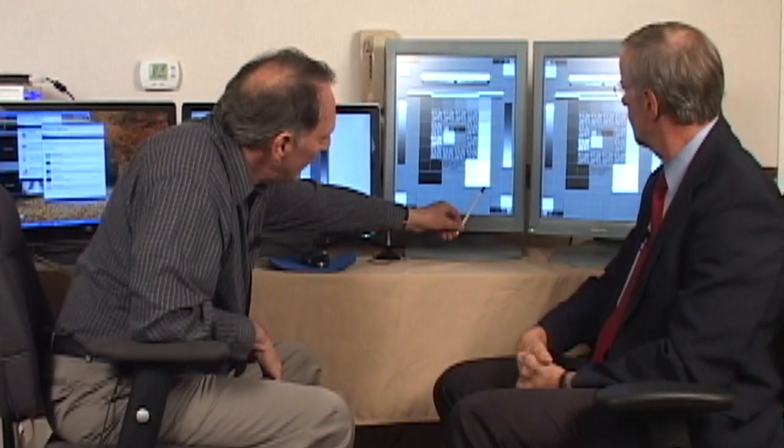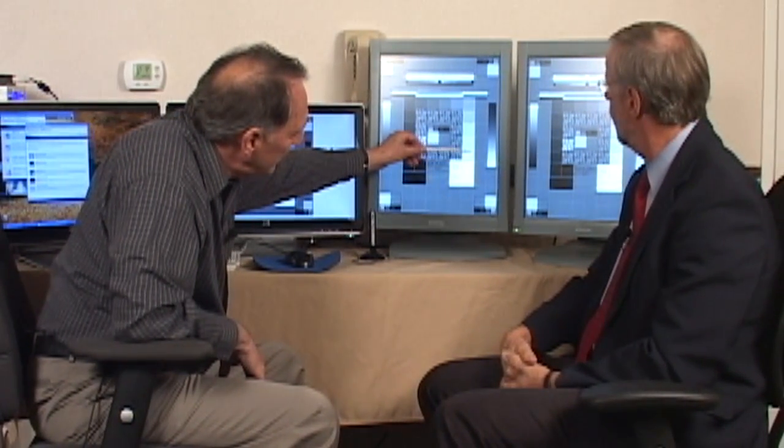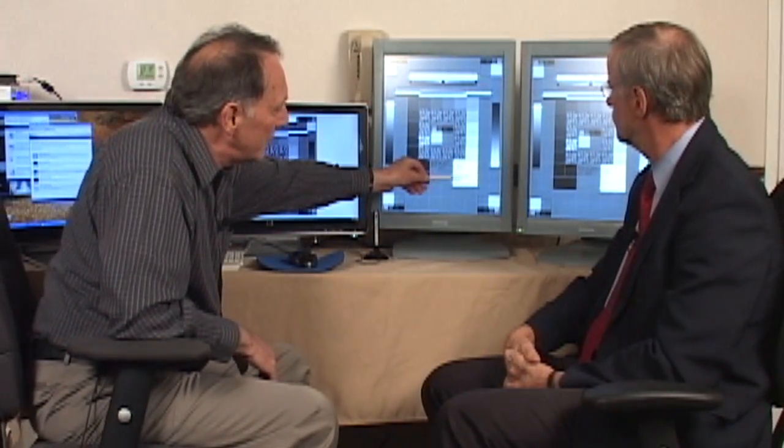Yeah, if you go back 4 letters, back to the T, which would be 4 digital driving levels difference, that's the same differential as the squares in the corner that are plus and minus above and below the surrounding area. So if this is questionable to you here, you start looking in these squares.